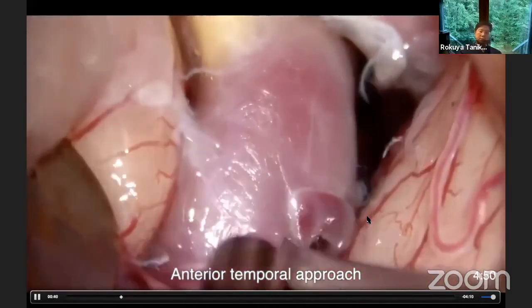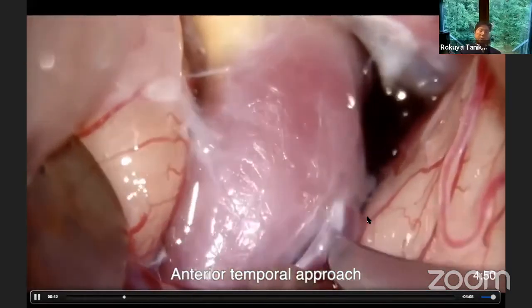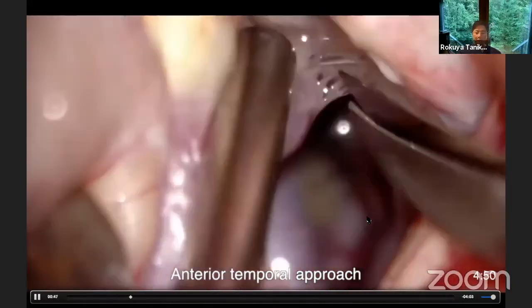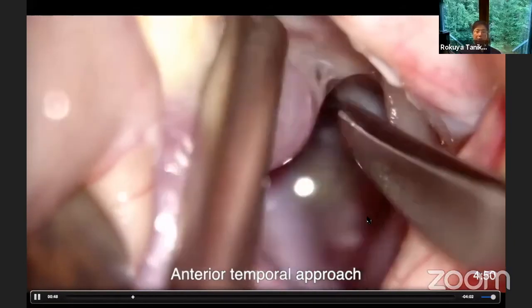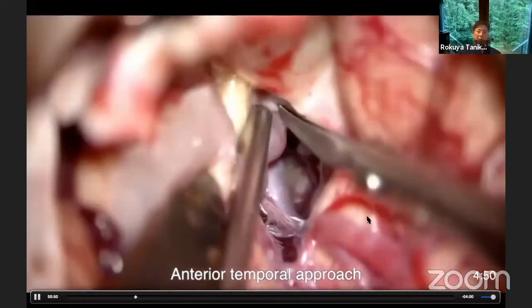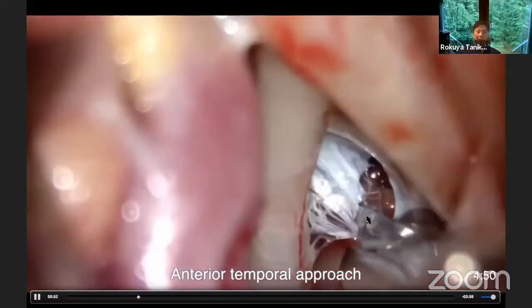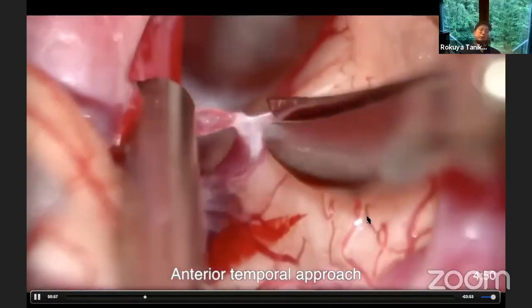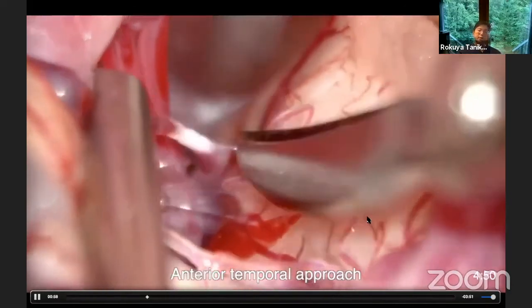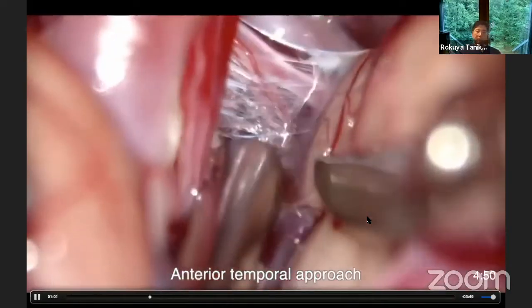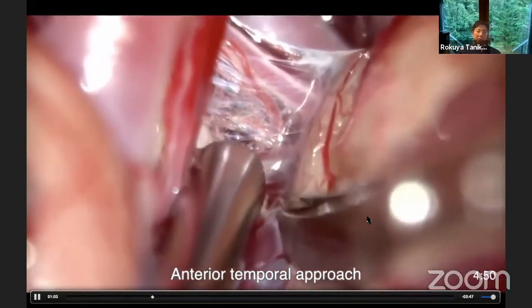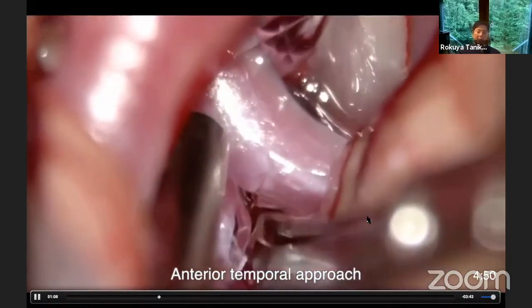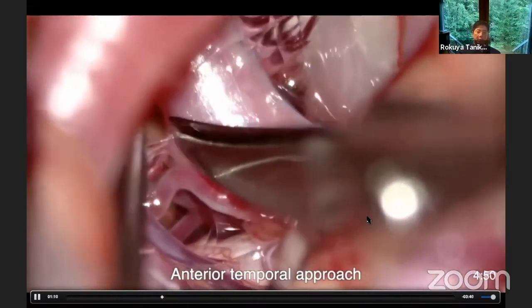This is the internal carotid artery C1 segment and the temporal uncus. Further dissection detected the origin of P1 and the cisternal segment of the oculomotor nerve, which is entering the cavernous sinus. The temporal uncus was attached to the oculomotor nerve and the veins. Now I am opening the ambient cistern.